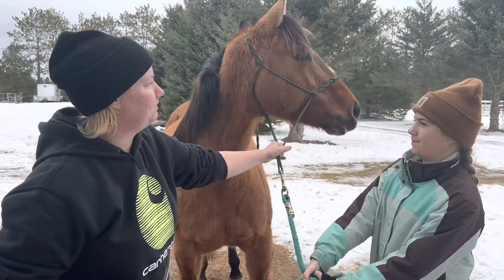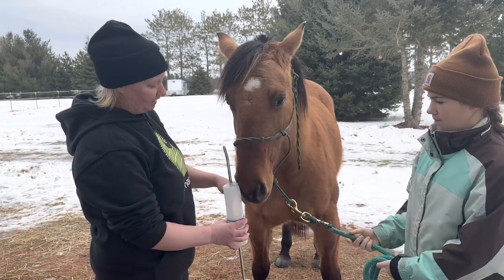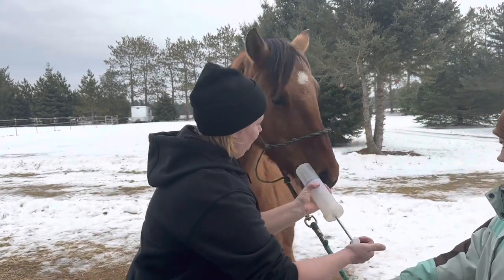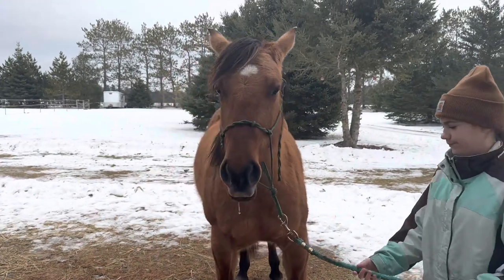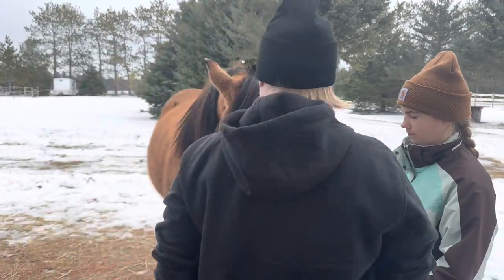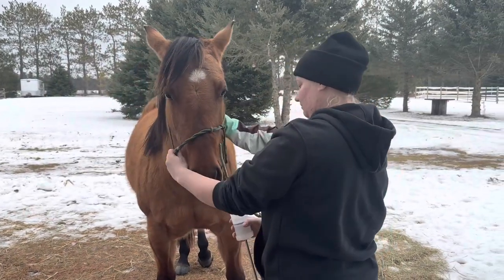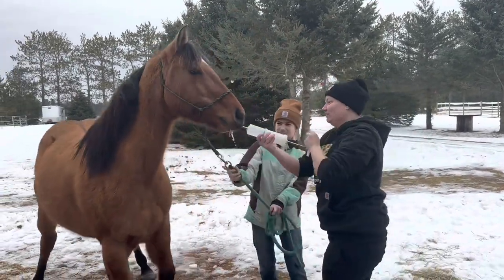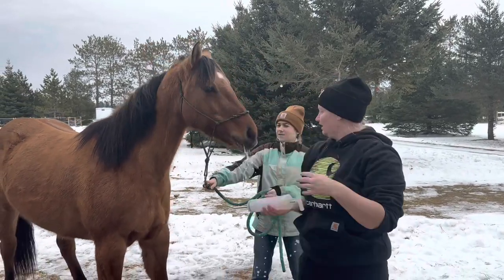So the first step here, we want to rinse out her mouth, so that way my blades have some clean contact. I can feel everything that's going on in there. Willow's fairly new here, so I honestly don't know her history of getting her teeth floated, and I don't know her behavior history. When Kaylin comes out, we always try to do our teeth floating without sedation first. If it's needed, it's needed, but we try without. So we're going to see how Willow does.